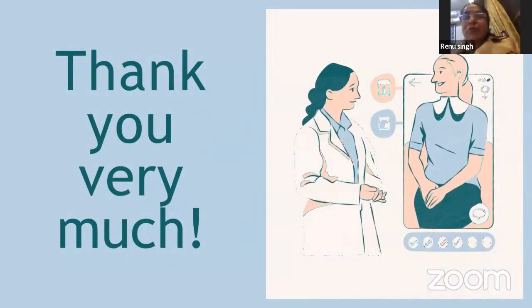Thank you, Dr. Rishikesh. Indeed, it was a wonderful presentation. And with bladder complications, you taught us even the VVF repair and it was beautifully presented. Indeed, for prevention of complications, specifically in laparoscopy, the most important thing is the planes. If we identify the plane, the vesicovaginal space, which we have to dissect, it can be by any approach, anterior, lateral, posterior, whatever approach it is. And then the judicious use of energy sources needs to be emphasized. Whatever energy source you are using, you have to be very cautious how it is used, what the lateral thermal damage is going to be, whether you have to keep the paddle for a longer period of time, and what complications can happen with different types of energy sources. And the sooner the better. It is good to identify on the table rather than waiting for it to happen later on.